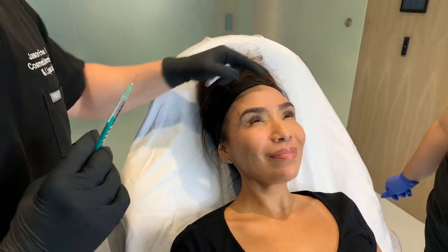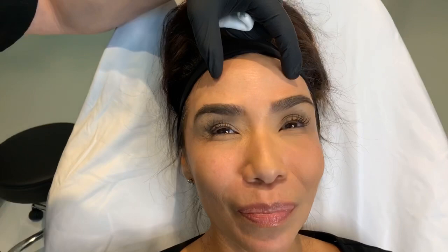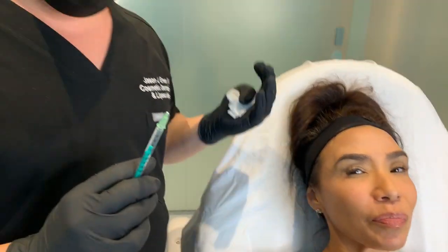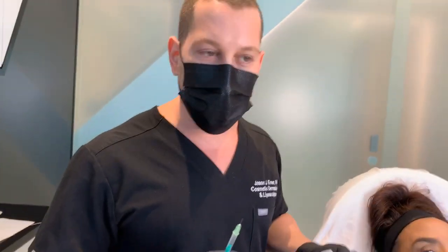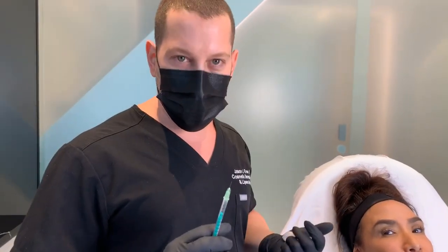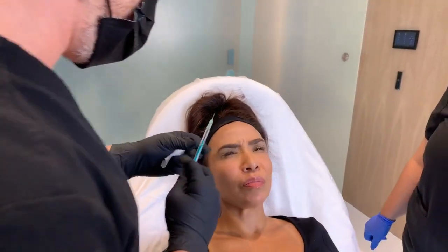The one thing I always tell people is it's nice to be a little more conservative on the forehead so you don't droop the brow. The problem is if you do that conservative approach, it only lasts about 6 to 8 weeks. So in her case, I'm actually gonna do a little bit stronger on her forehead, which will make her a little more, quote, frozen. But because she's an athlete, you guys, she tends to metabolize more quickly. I want it to last longer. So this will at least last for her 2.5, 3 months because we're gonna do a little bit stronger of a dose. So squeeze in again, show everyone you're getting mad.